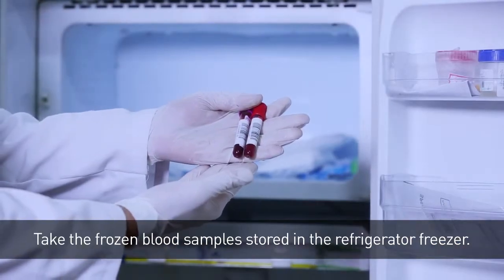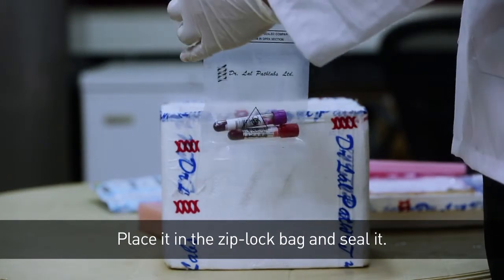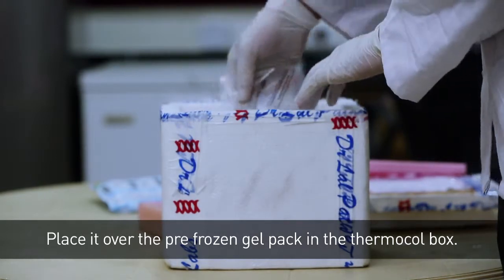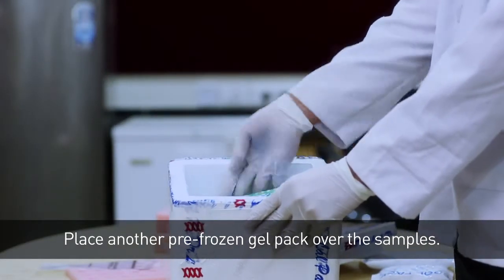Take the frozen blood samples stored in the refrigerator freezer. Place them in the Ziploc bag and seal it. Place it over the pre-frozen gel pack in the thermacol box. Then place another pre-frozen gel pack over the samples.